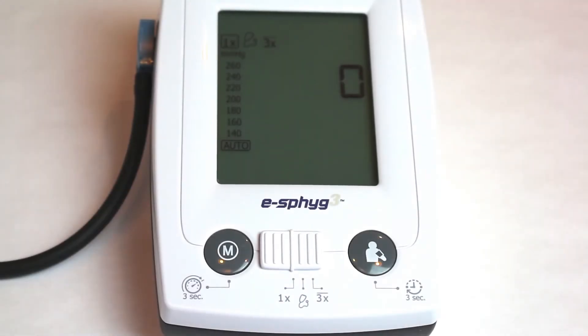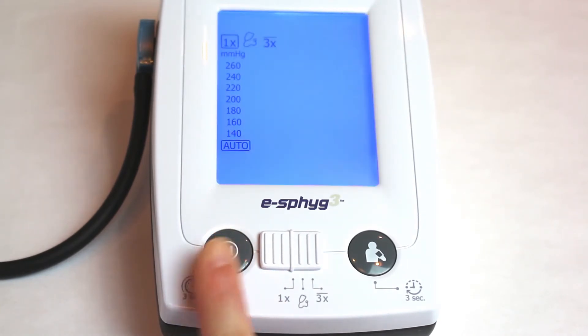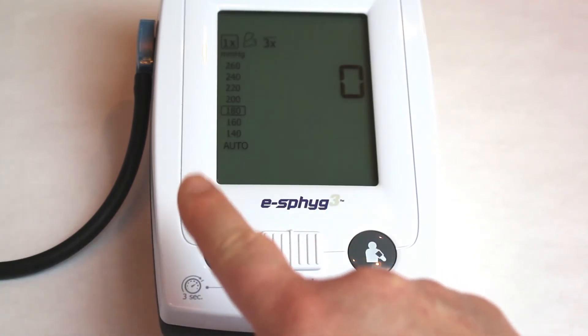If you wish to change the maximum inflation pressure, you can do so now. Press and hold the memory button for three seconds until the current value begins flashing. Press the start-stop button to change the value, then press the memory button again to confirm the selected value.